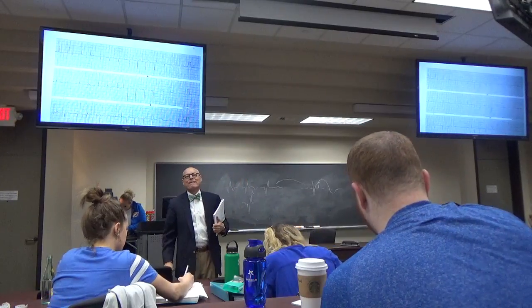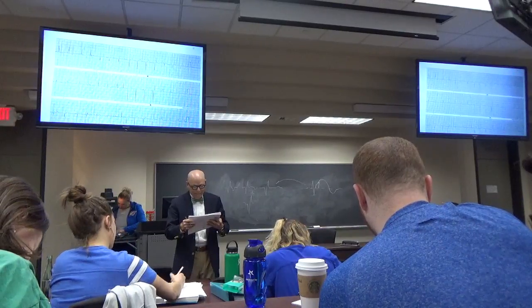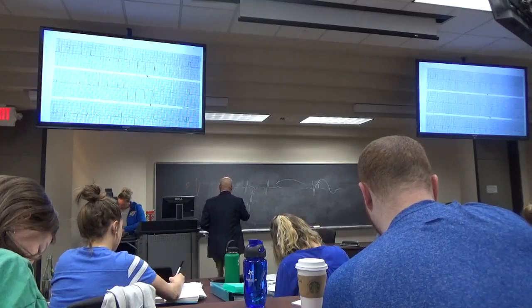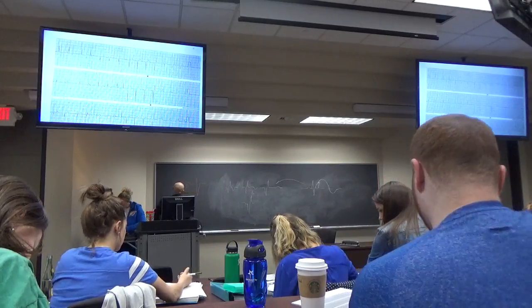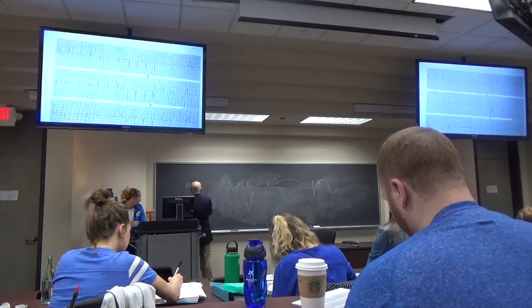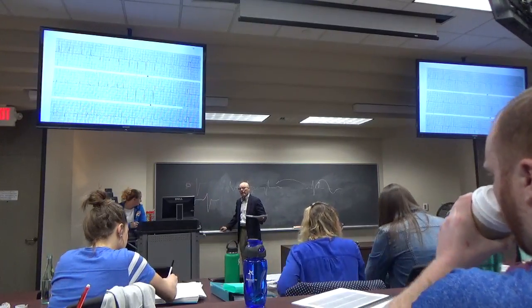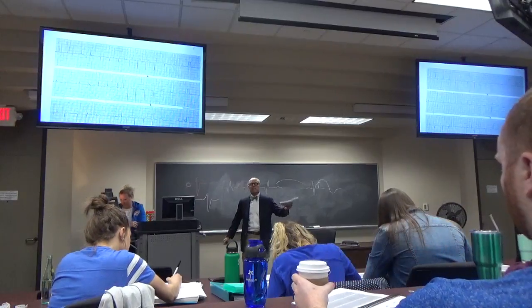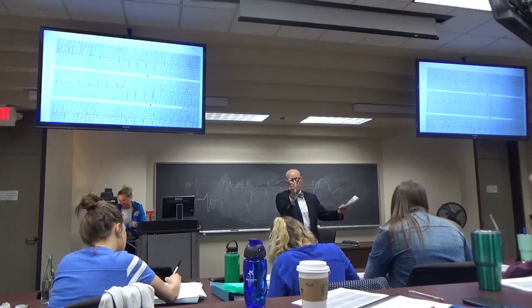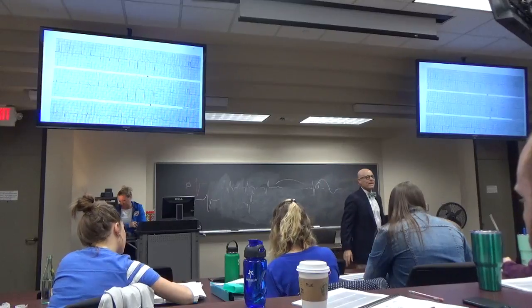I saw the P waves in V1 and V2 as inverted and not biphasic, so how can you tell? Because then I put junctional. Okay, so look what I wrote here. It's the terminal portion of that P wave that matters. If the whole thing is terminal, you got the same thing. So a flipped P wave in lead V1 is the same as a biphasic P wave, if it's 0.04 wide, 0.04 deep.